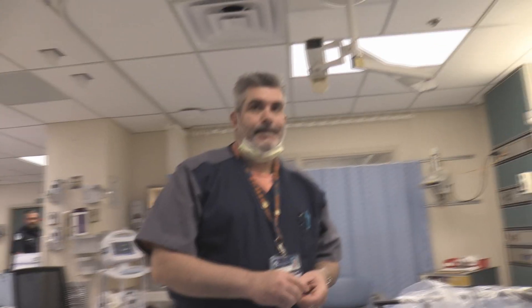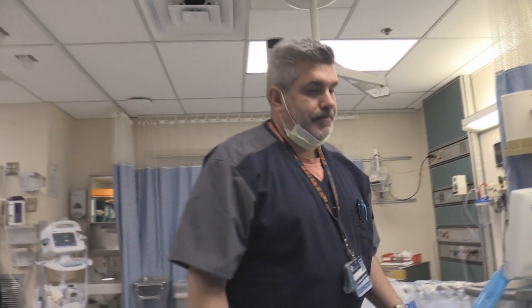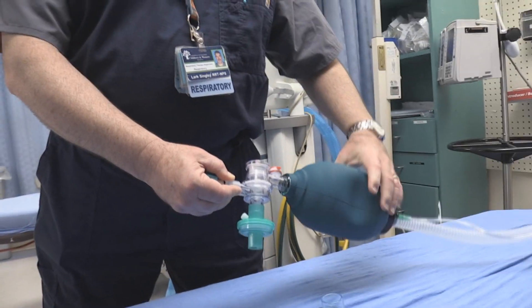If we're transporting a patient out of the ED who has been intubated, at our facility we generally don't set them up on the ventilator for transport. We would just continue using our filtered manual resuscitator.